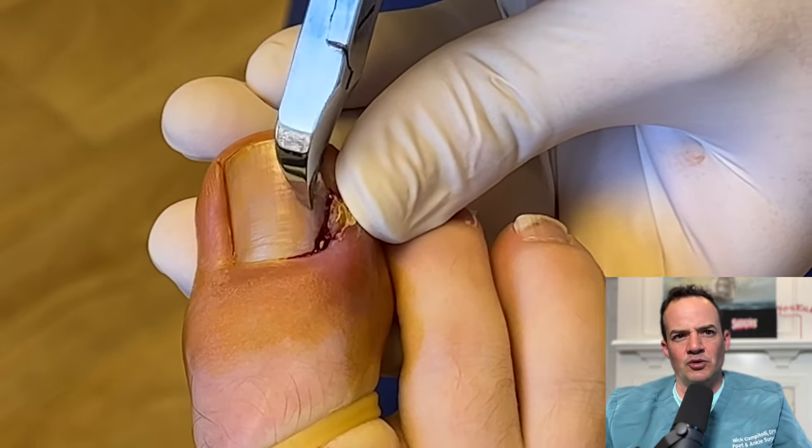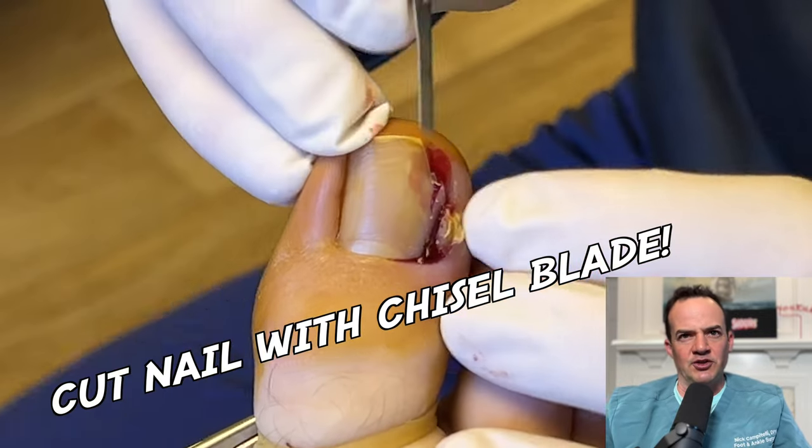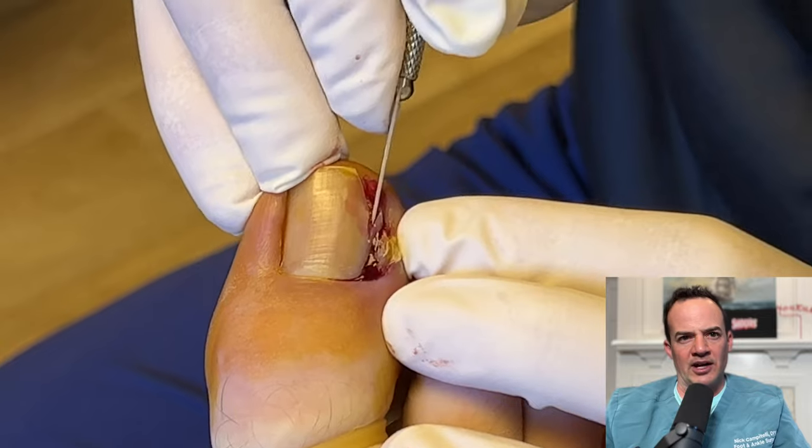After we start that cut — what we're doing here is just determining where we're going to start it — we use a chisel blade to then cut all the way back under the cuticle area.